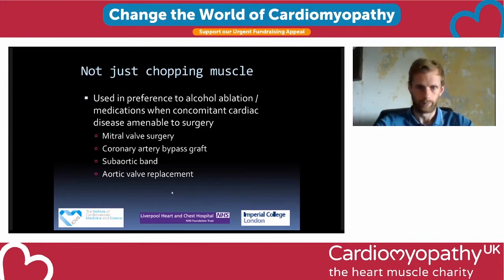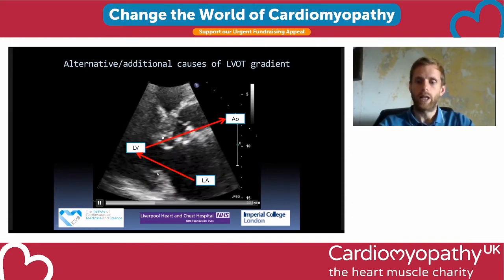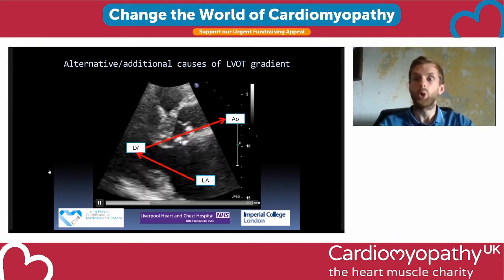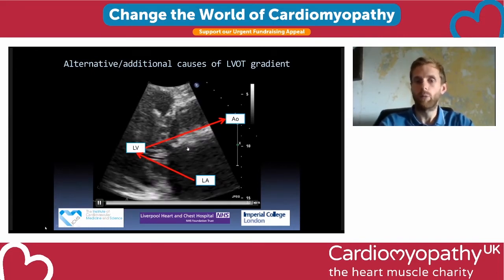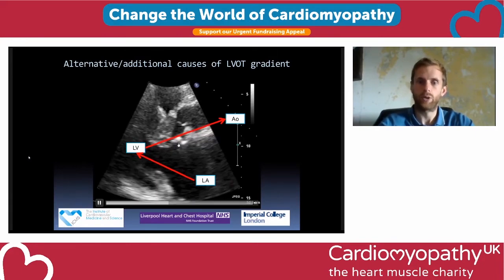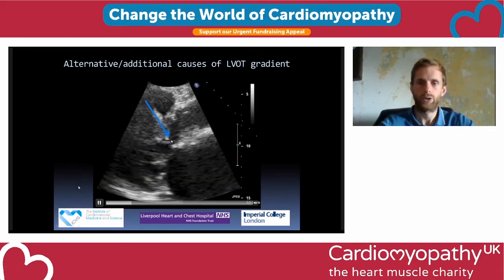So in here, this is now an echocardiogram, and blood's going in and out. And underneath here, we have a band on the way out. So it's almost like chalk. And this, even if you kill this piece of heart muscle, will not do anything. It won't make it shrink. It's already thickened and gristle type tissue. So this needs to be removed by an operation. This band just here.